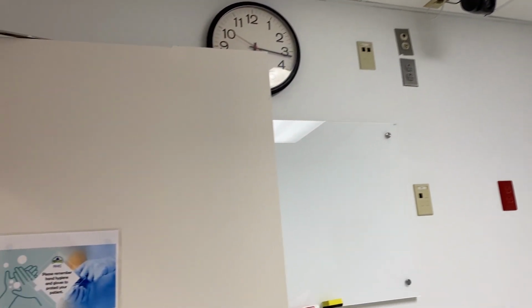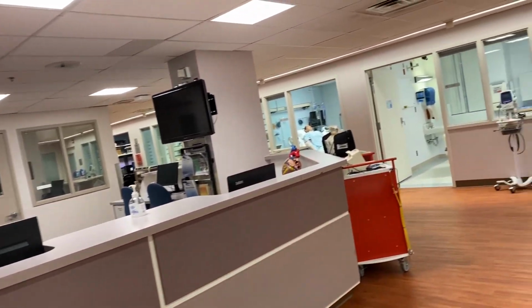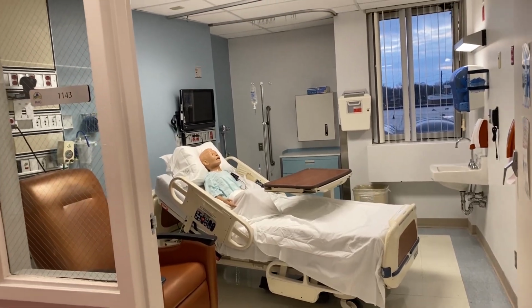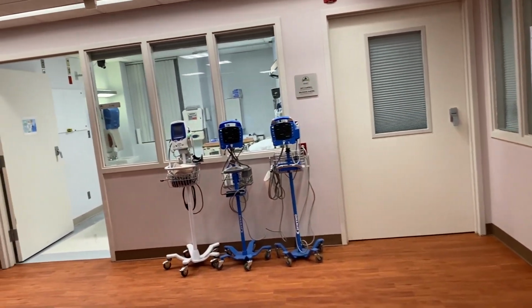The room itself has all the appropriate equipment in it. All of the air, oxygen is real because it was built as an ICU, so the oxygen is real. Vacuum is there as well.